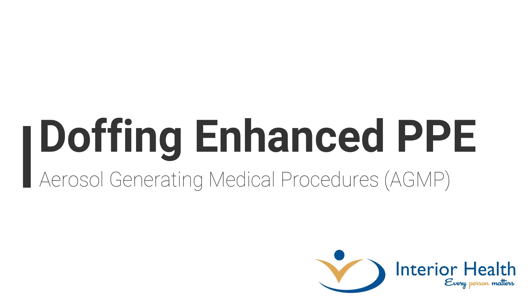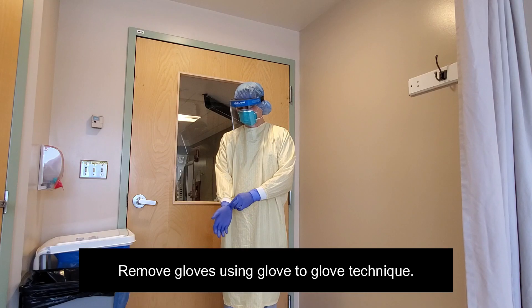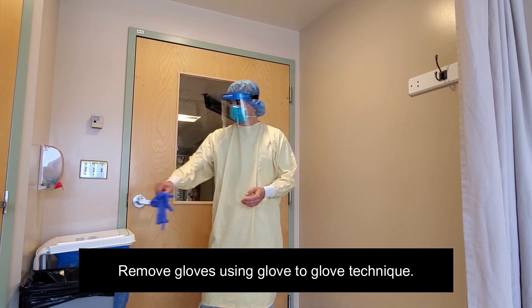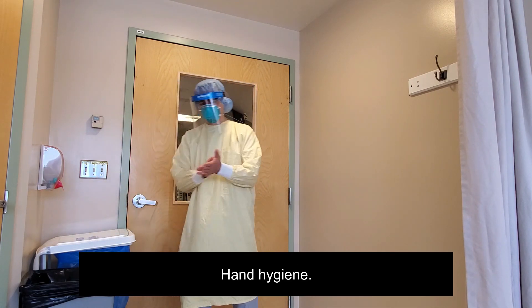Doffing Enhanced Personal Protective Equipment for Aerosol-Generating Medical Procedures, also known as AGMP. Remove gloves using the glove-to-glove technique. Perform hand hygiene.